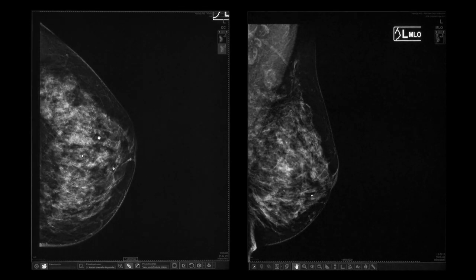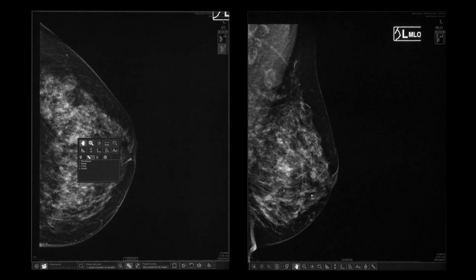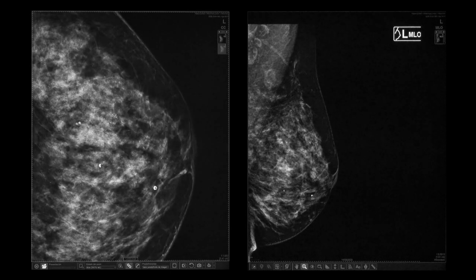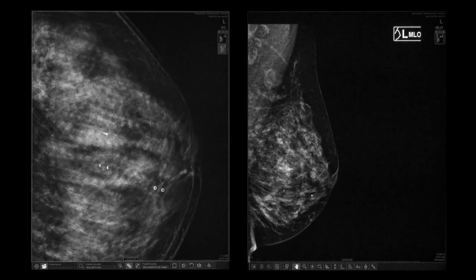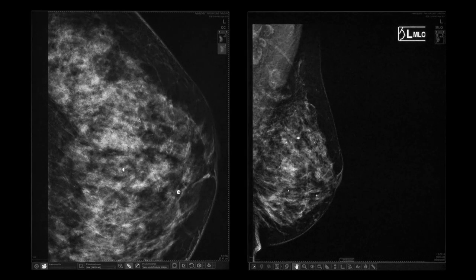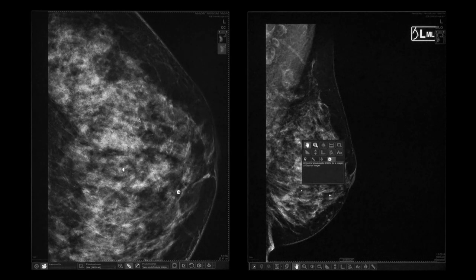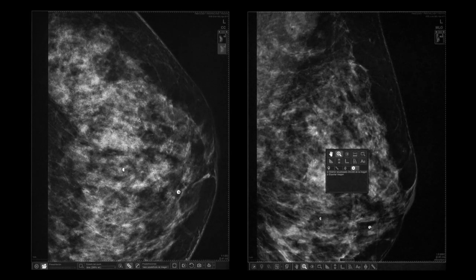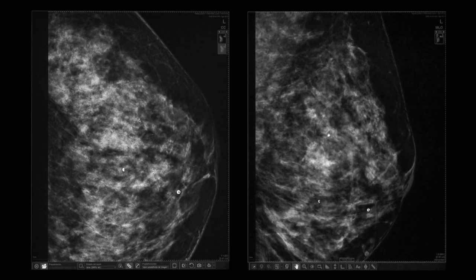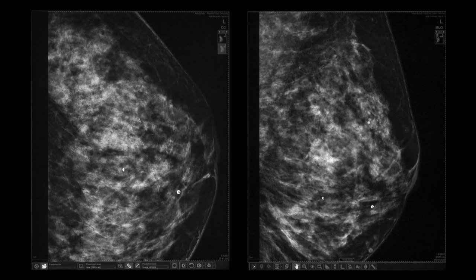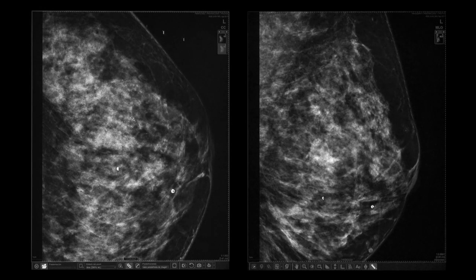In this clinical case, we have a small cluster of amorphous calcifications in the upper outer quadrant of the left breast, where a horizontal approach would be suitable, with external access in a sitting position, left side approach.